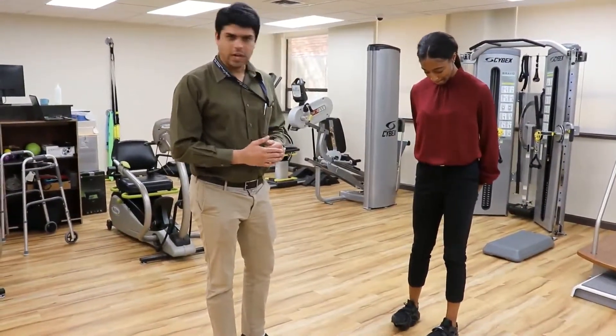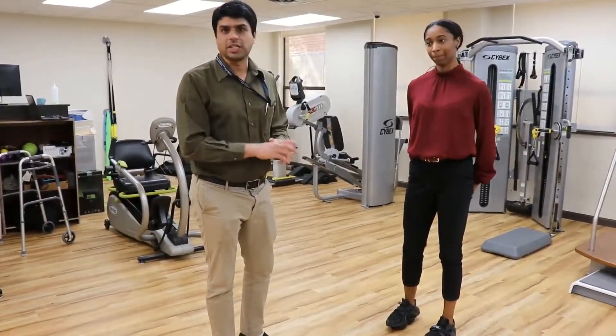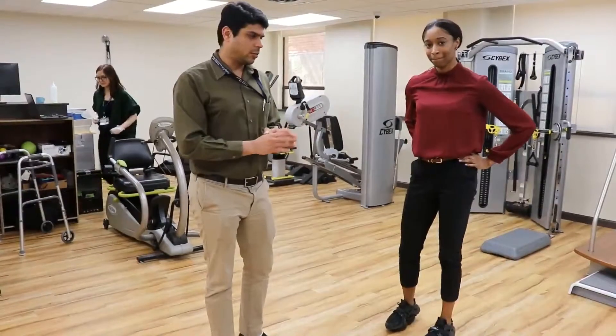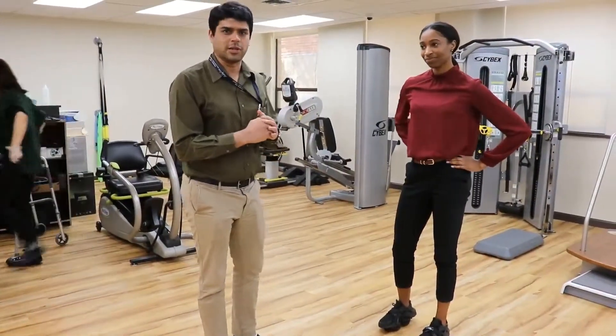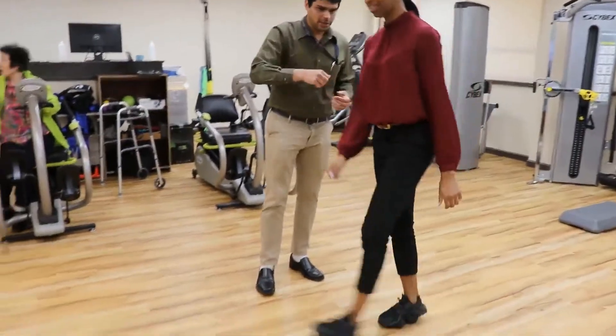So we're going to have her walk, run, and then we'll do some more fun stuff with Mel while she does it. We're going to be recording and then we'll see how she feels with this on, and then we get the champ to actually talk to us about how she feels with it. Walk there and run back.